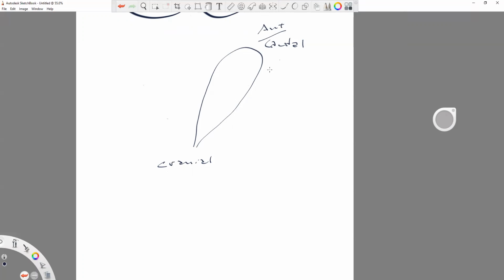So there is somewhat of a posterior to anterior tilt, but it's really more cranial to caudal. In other words, towards the person's head is the neck, and it hangs like a pear off of a tree. It just doesn't look that way on ultrasound.